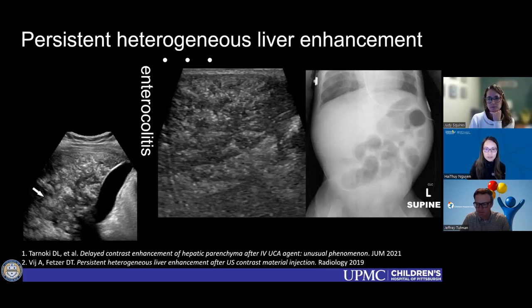I don't know if it's on every single machine, but I know on ours, I was told there's a button that you push that helps with tracking. You can let the machine automatically try to track, because obviously there's going to be motion associated. I found that to be helpful because it does attempt to stay on the lesion or the region of interest. Same. Yeah.